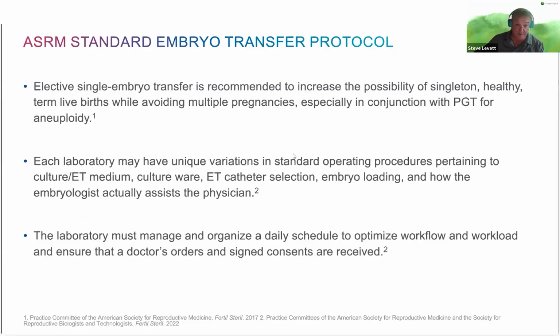They do say and recognize that there's no standard protocol. So each laboratory may have unique variations in their SOPs pertaining to what sort of culture and embryo transfer media you use, what plasticware and consumables, what sort of catheter, how you load the catheter, etc., etc. So they recognize, I think, that there's no standard here that everybody follows, and they give some leeway to organize things in your own clinic in the best way that you can.